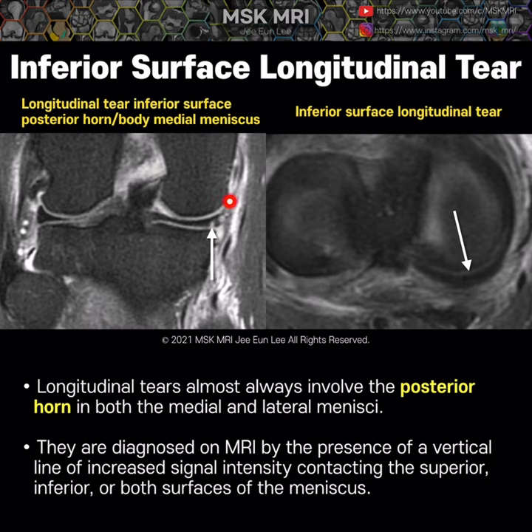In this longitudinal tear, it extends to the inferior meniscus surface and crosses parallel to the long axis of the meniscus on the corresponding axial image, consistent with an inferior surface longitudinal tear.